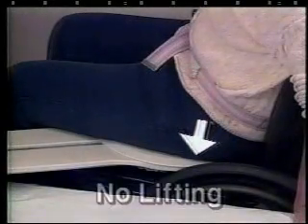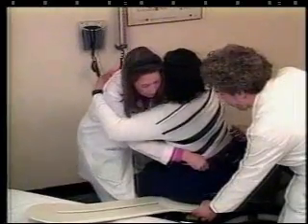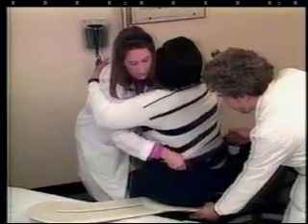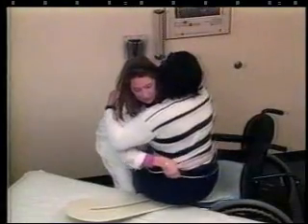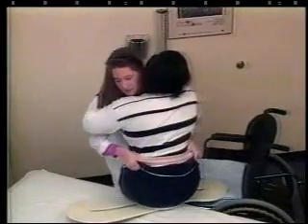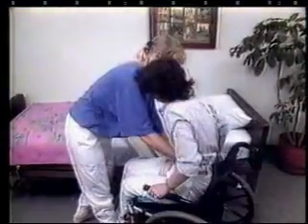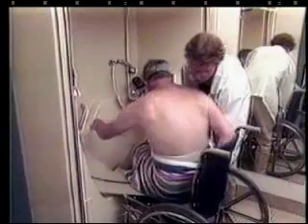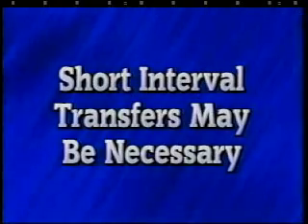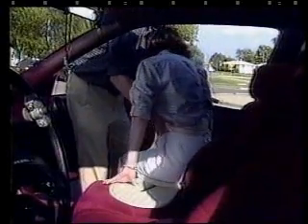No lifting. We generally recommend that we use the same number of caregivers when first using the Beasy. After everyone is accustomed to the Beasy, including the patient, we can usually reduce the number of caregivers to one. Frankly, there is so much good at stake, we must be a little patient with ourselves and move forward gradually. The product itself is not complicated. The challenge arises from the condition of each patient, and we know every one of them is different.